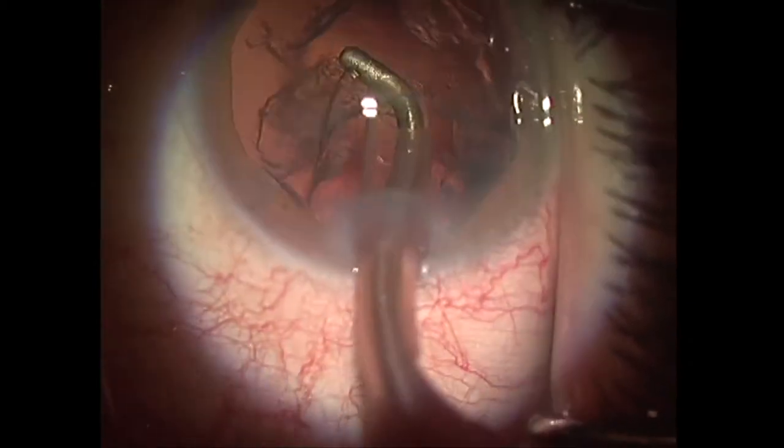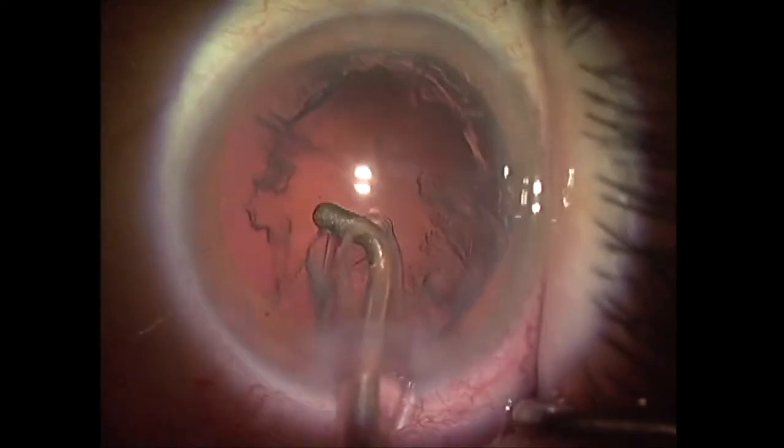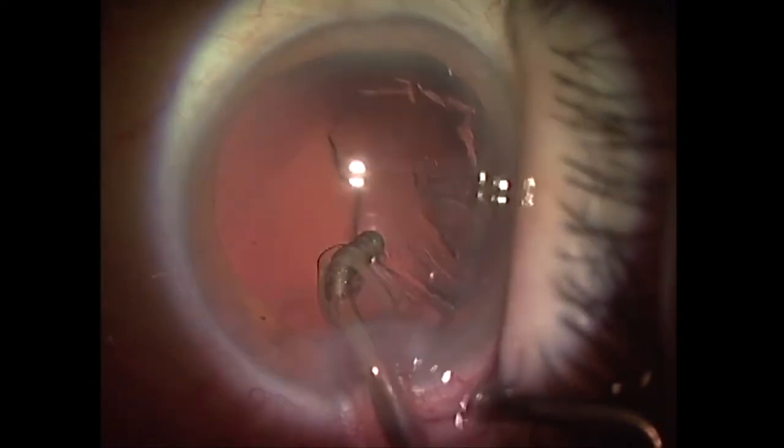Usually, there is no established sequence to perform this procedure, so surgeons choose randomly the next piece of the cortex to be aspirated.